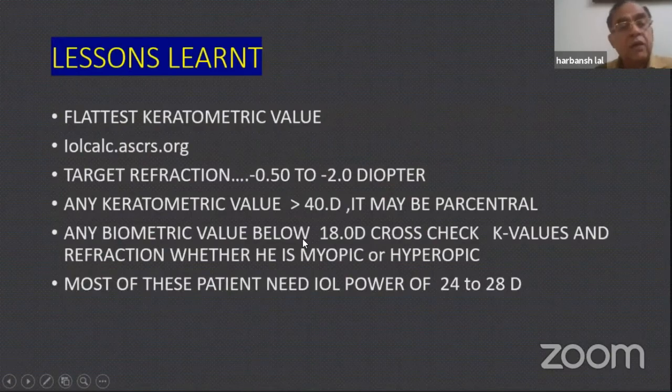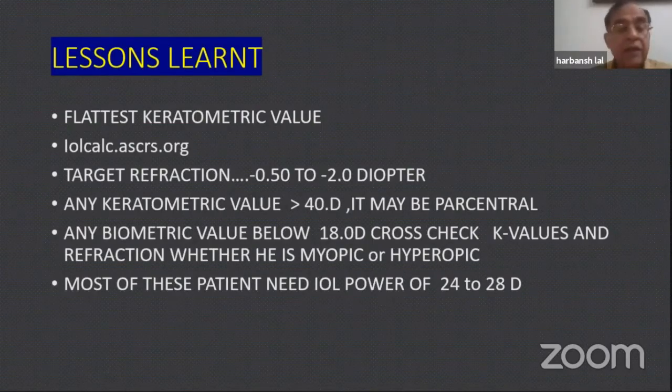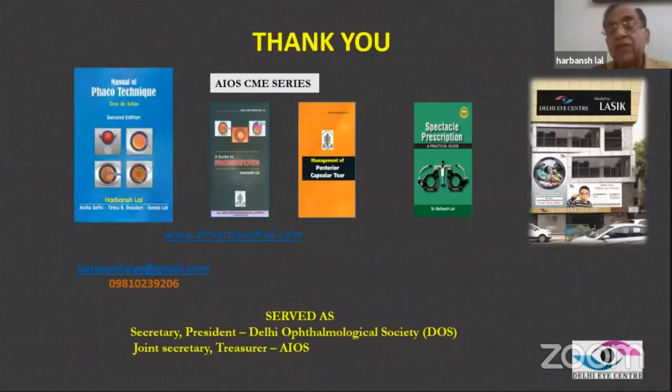So lesson learned: we need to take the flattest keratometric value, whatever we are getting. Target refraction should be minus 0.5, minus 2. Any keratometric value above 40, you are doing a paracentral. There is no doubt about it. Any biometric value below 18, cross-check everything. Unless the patient is using minus glasses, if it is slightly hyperopic, that means there's an absolutely wrong reading. And most of these patients will have the IOL power needed between 24 to 28 diopter. So this we can prove. An IOL exchange and a secondary IOL implant is always an option.